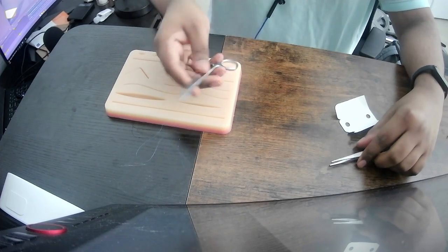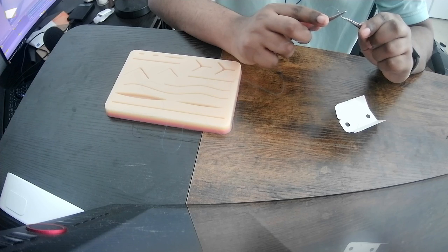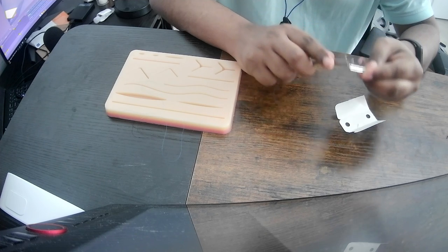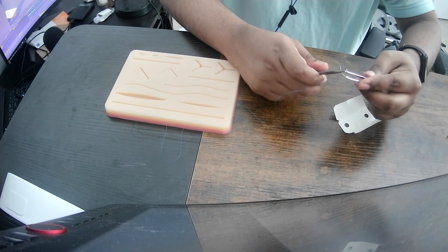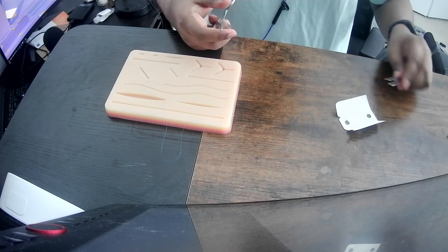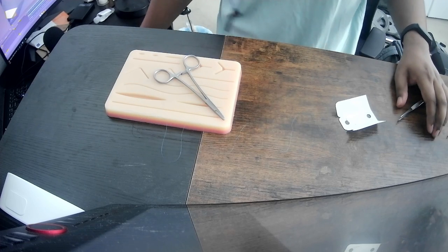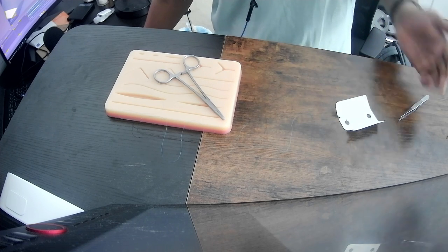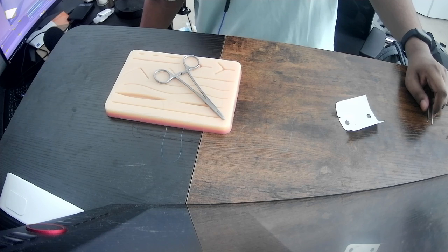Okay. Let's unload this. There we go. Oops. Yeah, it's so much easier to operate when the two-pronged side of the Addison's forceps is away from me. Okay, so let's see what's next on the video. I'm making decent progress. I thought this would take me a lot longer, but yeah, it's a lot harder than it looks, trust me, for a beginner like me.